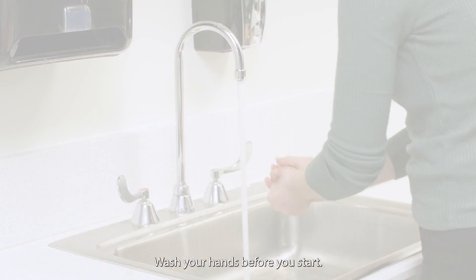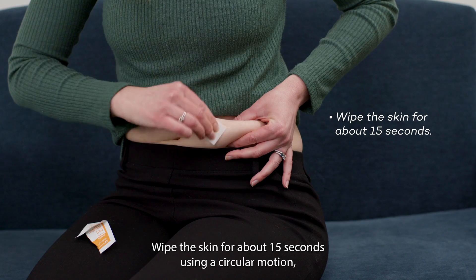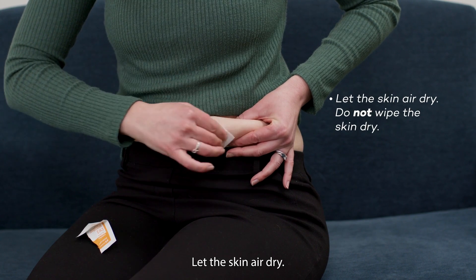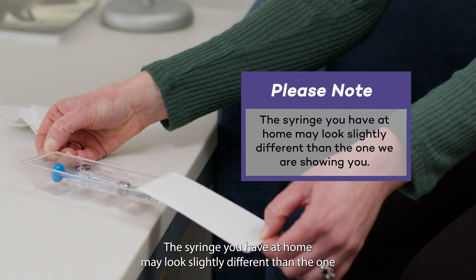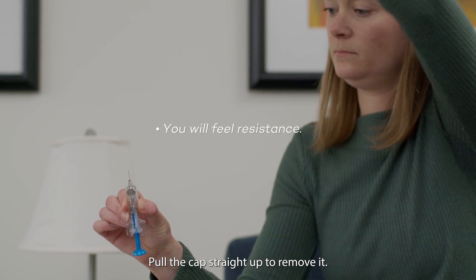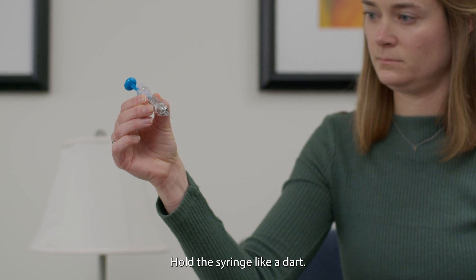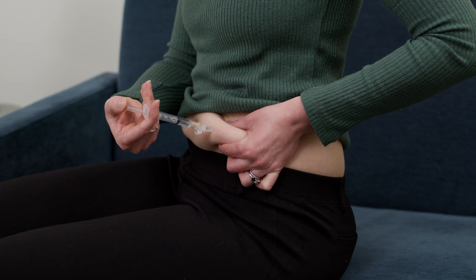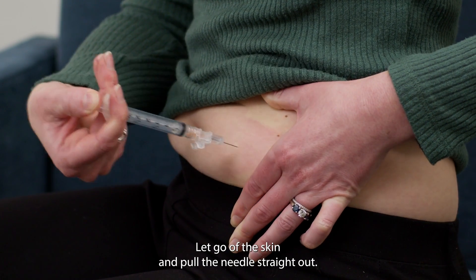Wash your hands before you start. Move clothes out of the way. Use one alcohol swab to clean the skin you will inject. Wipe the skin for about 15 seconds using a circular motion starting at the center and moving outward. Let the skin air dry — do not wipe it dry. Then prepare the syringes. The syringe you have at home may look slightly different than the one we are showing you. Take the syringe out of the package and pull the cap straight up to remove it. Once you remove the needle cap, don't put the syringe down or let it touch anything. Hold the syringe like a dart. Gently pinch the skin at the injection site. Fully insert the needle straight into the skin at a 90 degree angle. Slowly push the plunger until all the medication is gone from the syringe.